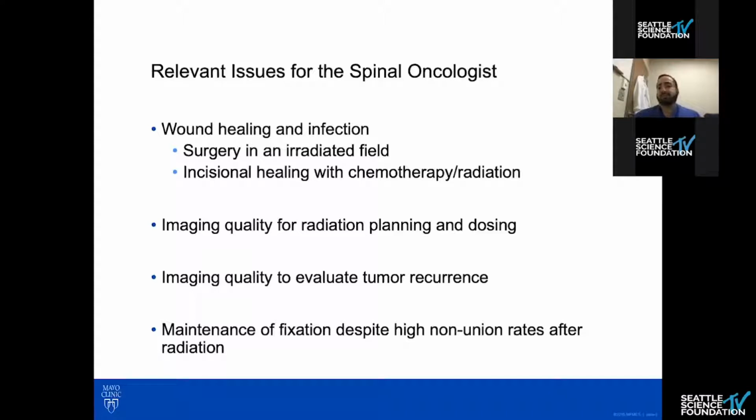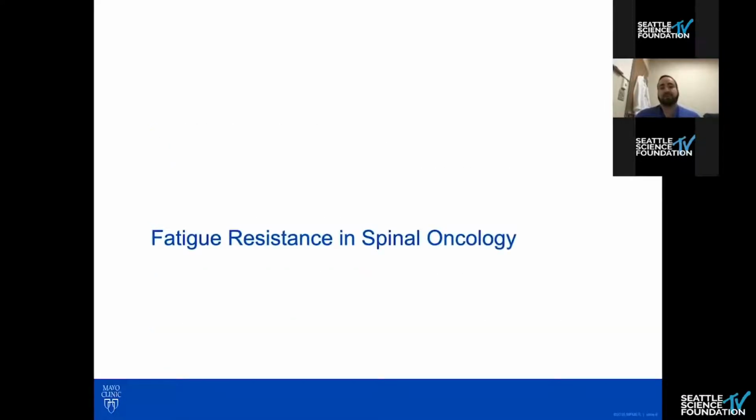And of course, maintenance of fixation is a big deal. A lot of these patients, almost all of the metastatic lesions, will go on to get radiation to their field. So as patients are able to live longer and longer lives because of good immunotherapy, good chemotherapy, and good radiation, we're having to deal more and more with the consequences of their systemic therapy, which is typically, as relevant to us, non-union. So fatigue resistance, so the biomechanics, and I'm hoping the question that was brought up can be answered here, or at least maybe it'll change in your mind how the question that you're thinking about asking. So fatigue resistance is very important, and that's mostly to that last point of the biomechanics.